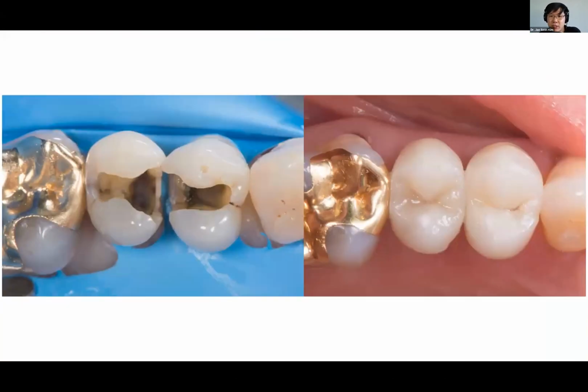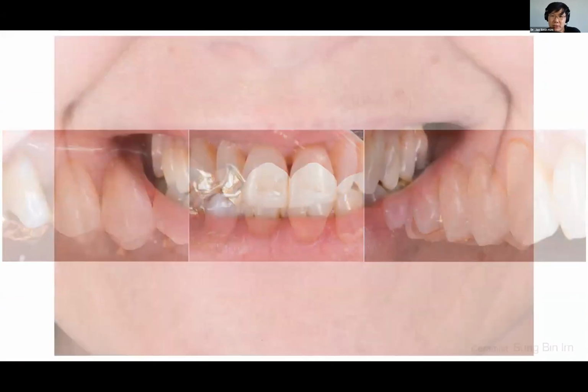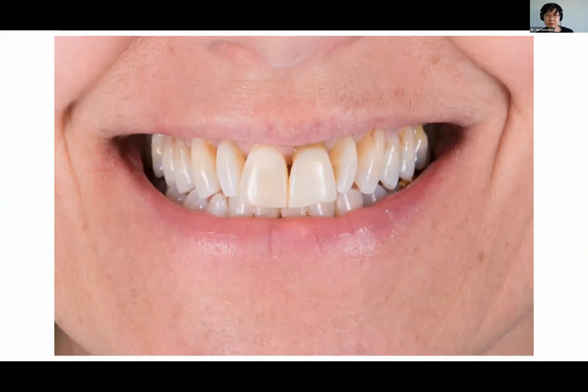And again, in this one, we were trying to mimic the cervical aspect of the restoration. You can see this patient had a lot of recession, and she had a lot of class 5 composites. And you can see 4 and 5 blend in really well with the patient's dentition. And these are all possible because buccal shots and occlusal shots were all taken. So, all right.